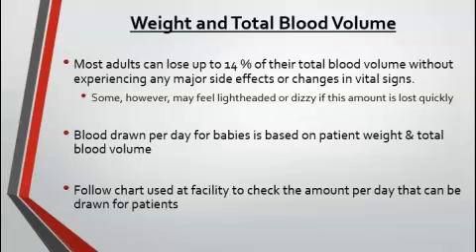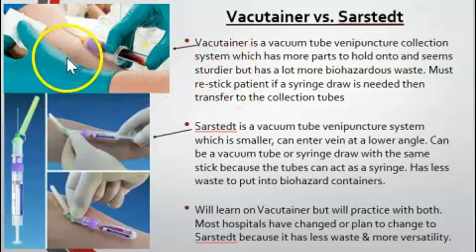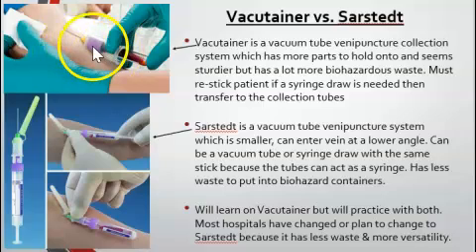There's a few different companies out there that make phlebotomy supplies, and depending on your clinical location or where you work, depends on which system they use for phlebotomy. The first system that you see up here is the one that we've talked about and seen examples about, and it's the most common one that you'll see in your clinical sites. This is the vacuum container system with the double-sided needle and the tube holder that you insert the tube in, and it's pretty bulky as far as what you hold on to.